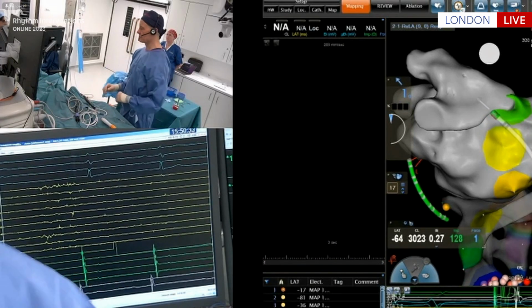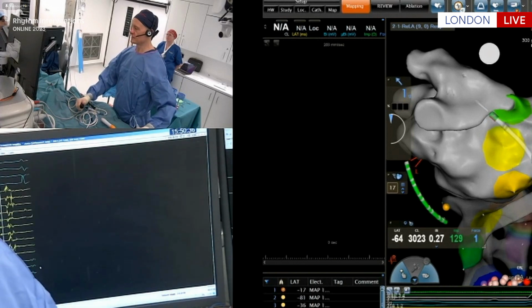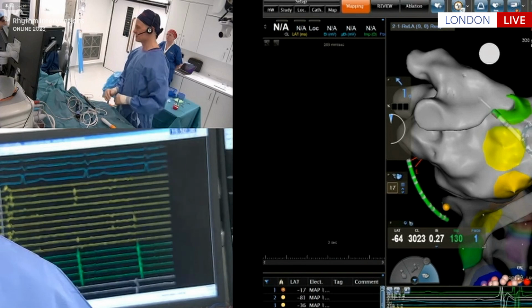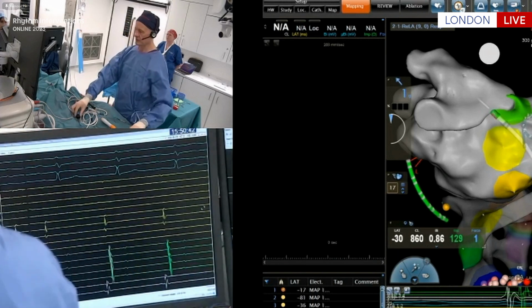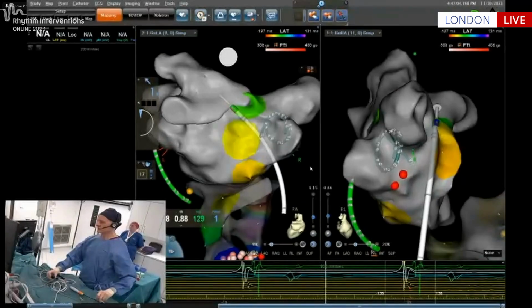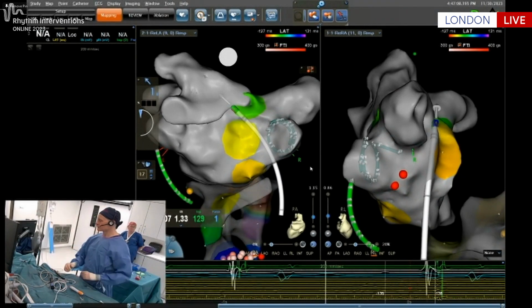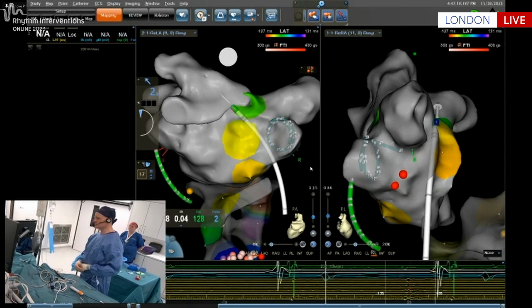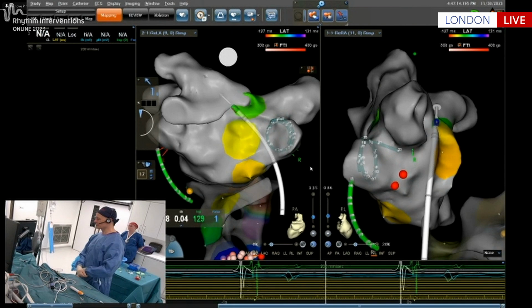I'm not thinking about the patient at all because I've got Sachin, the brilliant anaesthetist, just keeping an eye on everything, making sure the ACTs are okay and that he's happy with everything, because we work together all the time. So he knows exactly what's meant to be happening. So if I'm distracted, he'll pick it up. So that's the PV right back at the os.